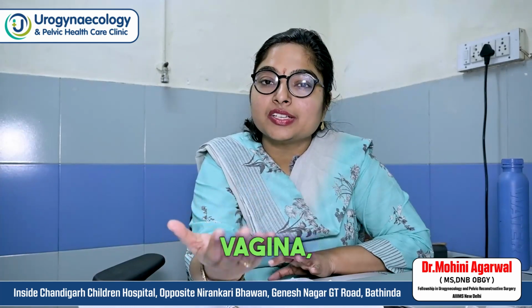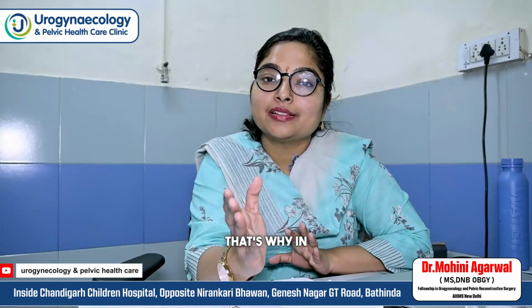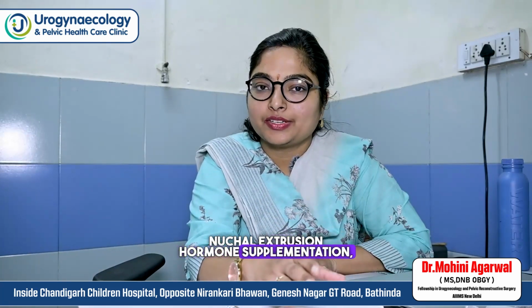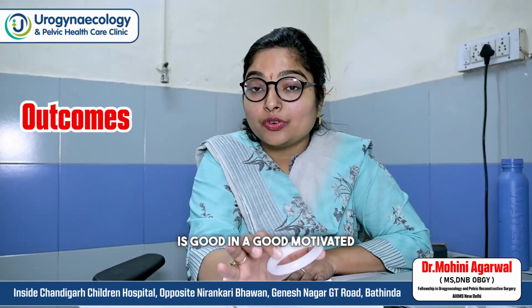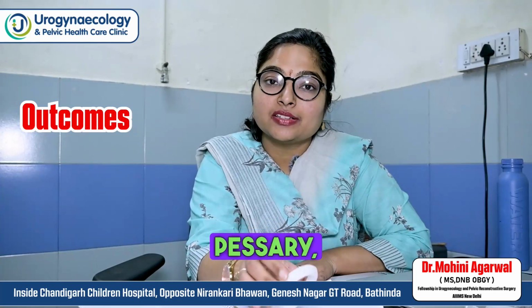If it is an atrophic vagina, then the chances and severity of complications increase. That's why, when inserting a pessary in a postmenopausal female, you first apply local estrogen hormone supplementation. Outcomes are very good. Patient compliance is good in a motivated patient who is willing. 70 to 92% of patients have a good outcome with the pessary. Her symptoms are gone.